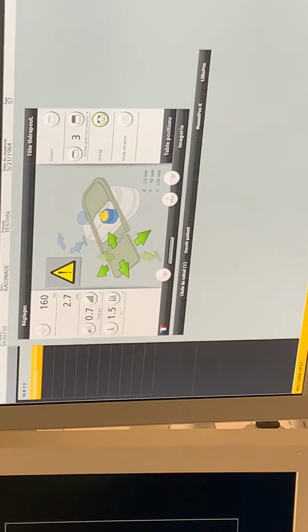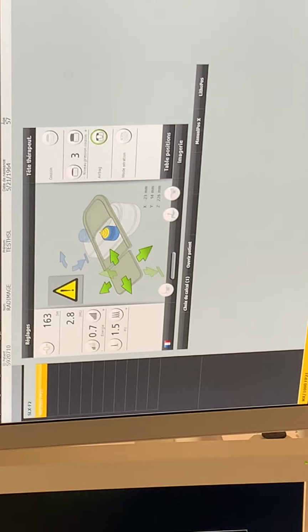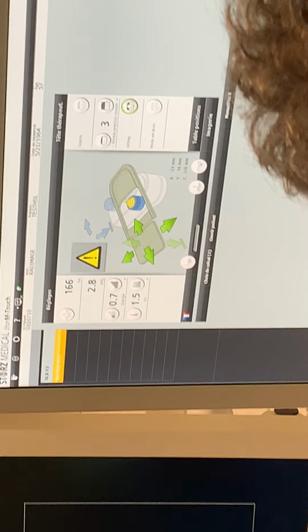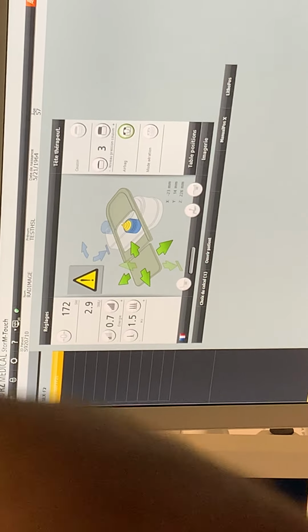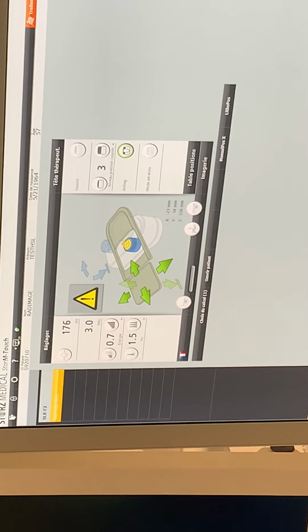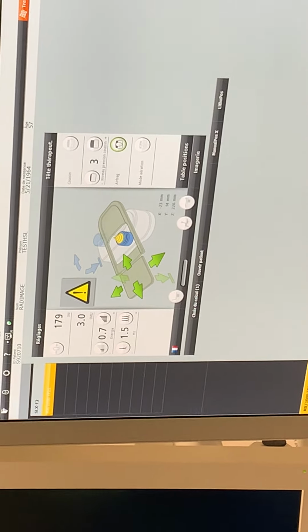See. By the way, it's because we don't understand if you move. It disturbs a lot. The only thing is, yeah, no problem. No problem. It is working. If Kevin is telling exactly the same, then it is fine.